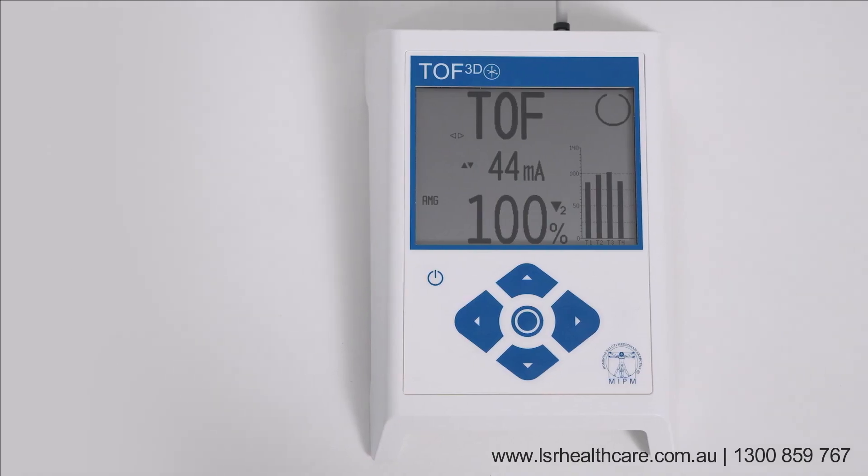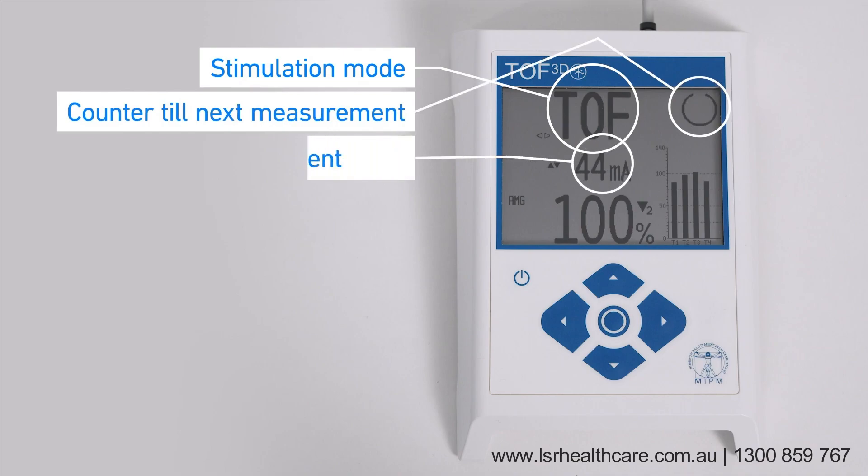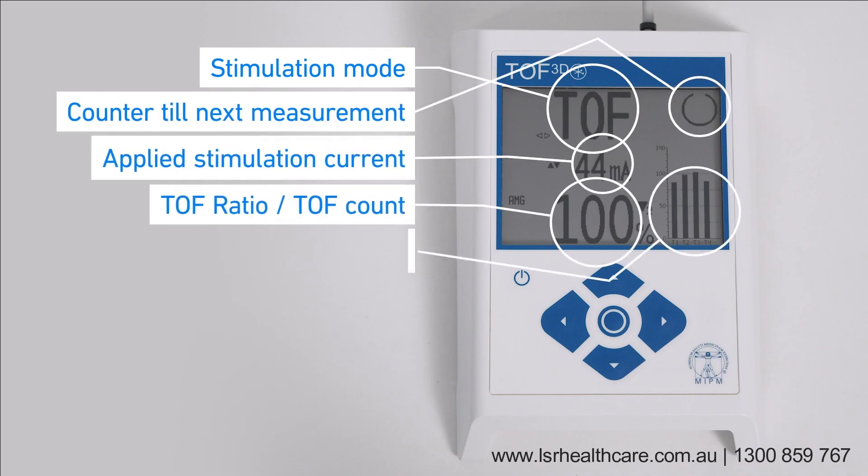TOF3D monitor. Stimulation mode, counter till next measurement. Applied stimulation current. TOF ratio and TOF count. T1 to T4 response or trend.